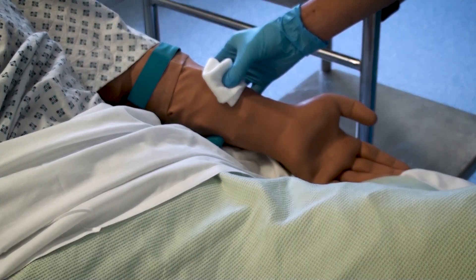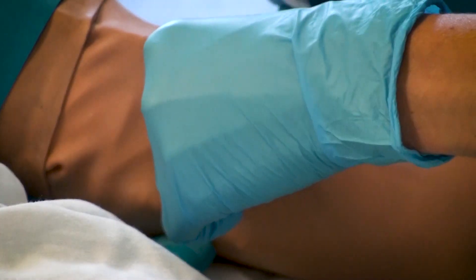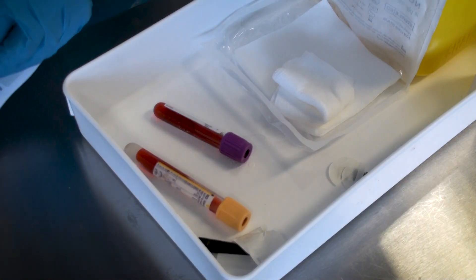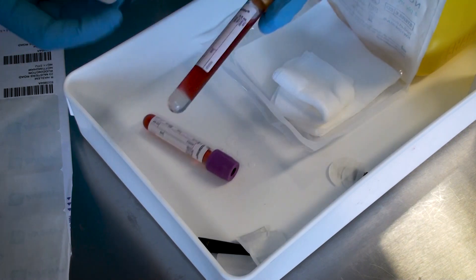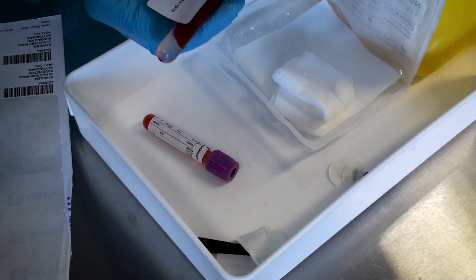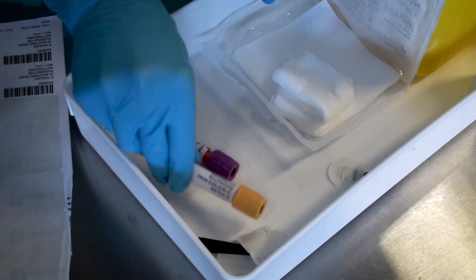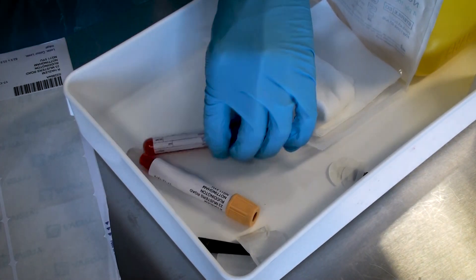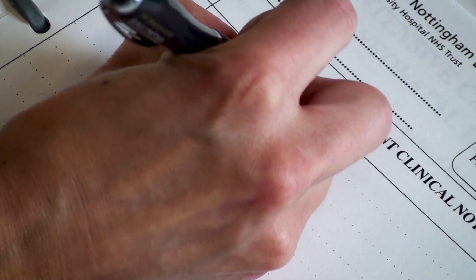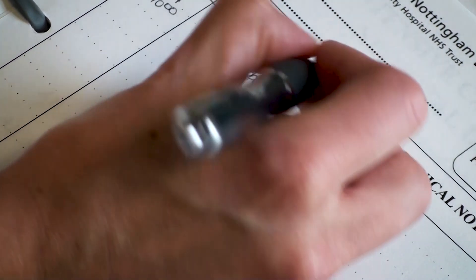Apply the needle safety device and dispose of it in the sharps bin. Ensure that you have applied adequate pressure on the wound before applying a plaster or dressing, then adequately label the blood bottles and complete the lab request forms. Remember, the only samples that cannot have patient identity labels are the pink bottles used for cross-match or group and save — these bottles must only ever be handwritten. Ensure the patient's comfort at the end of the procedure and ensure the samples are sent in a timely manner. It is the responsibility of the person who ordered the blood test to check the results.